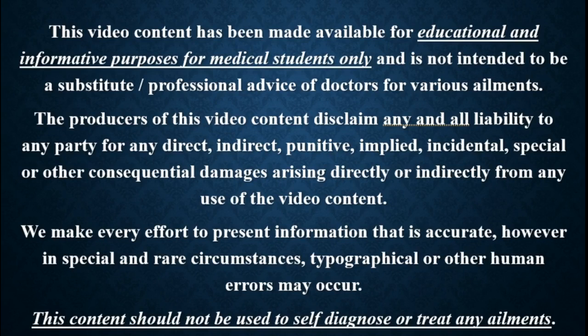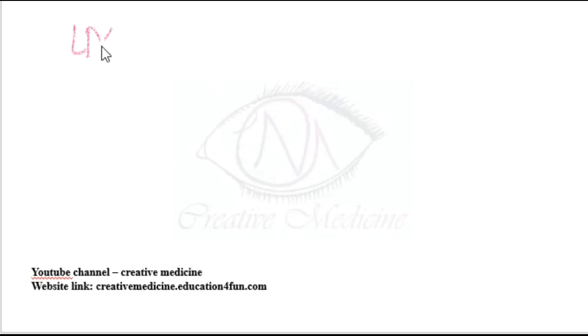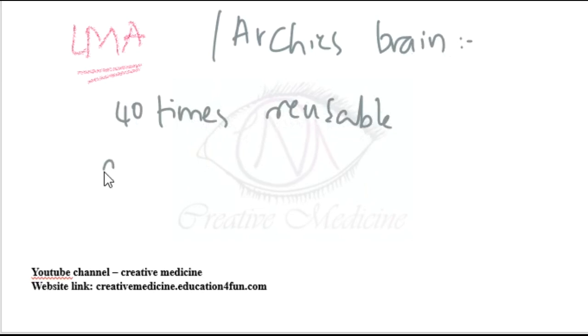In this lecture, we will learn about Laryngeal mask airway. Laryngeal mask airway was found out by Archie Brain, so it is called as Brain's mask. Laryngeal mask airway can be used up to 40 times. Uses of laryngeal mask airway: emergency airway for failed or difficult intubation and for elective intubation.